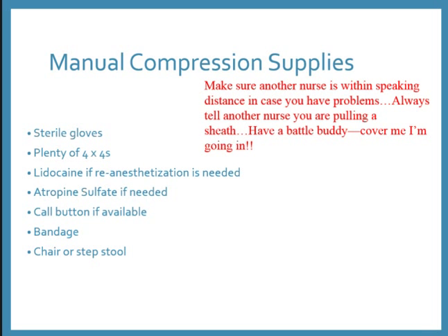We don't use lidocaine. You and the patient both should have access to the call light. Some sort of bandage, you can use the BioPatch and Tegaderm. And if you are vertically challenged, you may want a chair or step stool. Even if you're not vertically challenged, you may get tired after a while. Our beds are very high, so have a chair or a step stool.